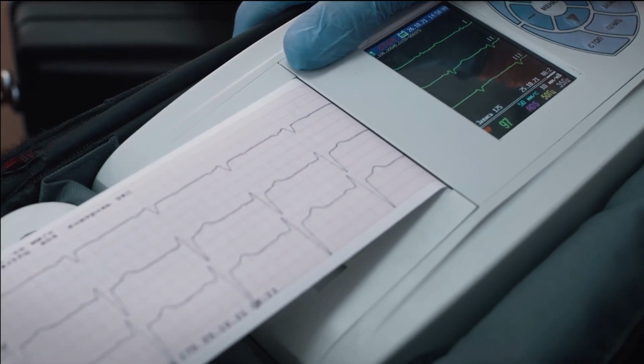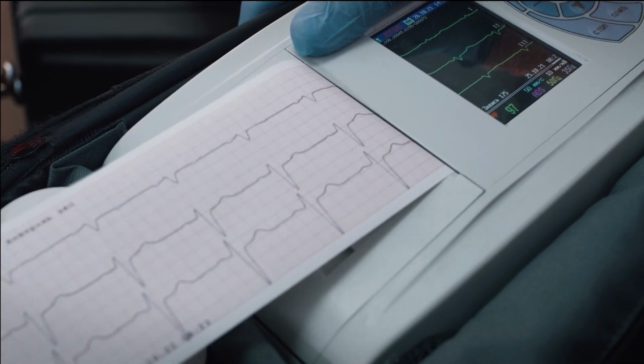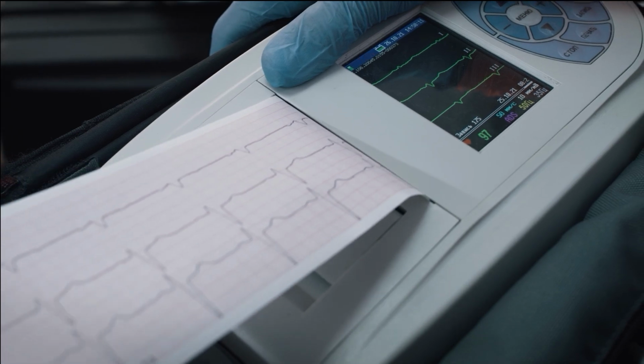Now, this could be something that we discover on cardiac patients as we work with them, but it's also something that we might observe for an ER patient that no one knew had any kind of cardiac problem at all. So we need to be able to very quickly glance at an ECG waveform and recognize there is a cardiac problem. What is the problem? Well, we have three choices. It could be a myocardial infarction, it could be myocardial injury, or it could be myocardial ischemia. So let's learn about those.